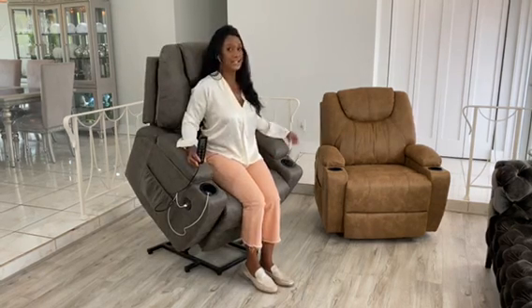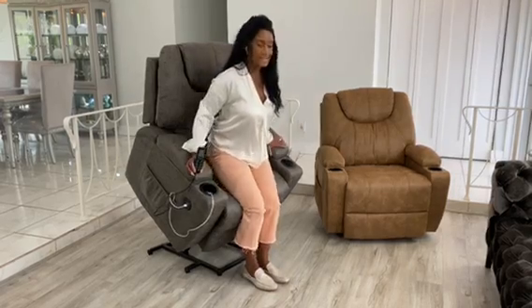And this is our power lift chair. This is ideal if you or your loved one needs a little bit of assistance transitioning from the standing to the seated position.